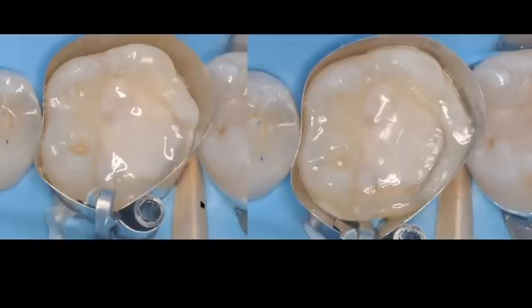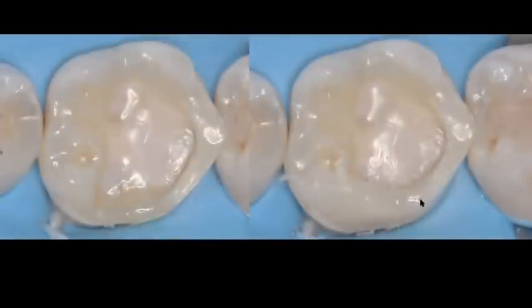And what the centripetal technique states is that we want to build the missing walls first. So if you have an MOD preparation, you're going to build your mesial wall and your distal wall first. In this particular case, we're missing the entire buccal wall and part of the distal wall. The first thing that we're going to do is build those distal and buccal walls that are missing. And you can see here, I have added composite to build the distal and distal buccal aspect of this tooth. And then I'm going to do my second layer to close that buccal wall and create that ring around this tooth.